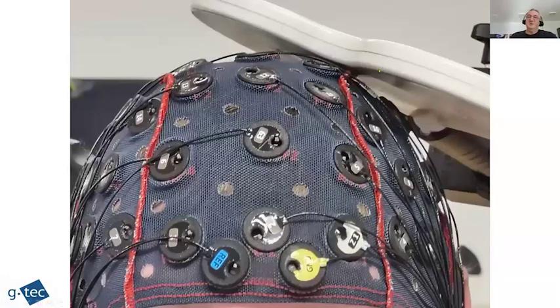And you can see that we can actually come very close to the head, just like with passive electrodes. The small difference between these electrodes and passive electrodes is that they have some electronic circuit in them, which pre-amplifies the signal, and that would actually speed up the preparation time, which is important.